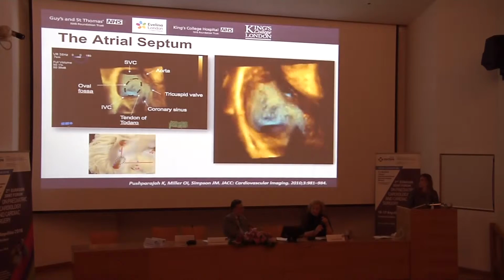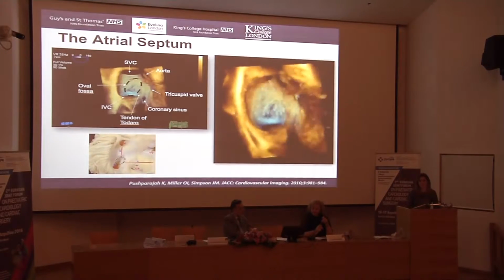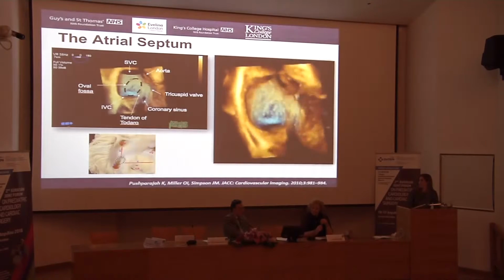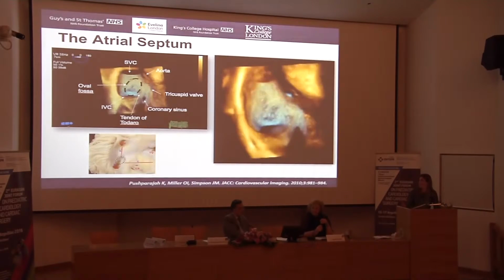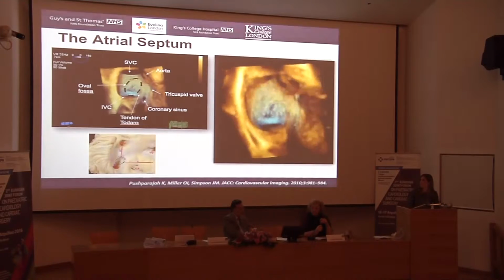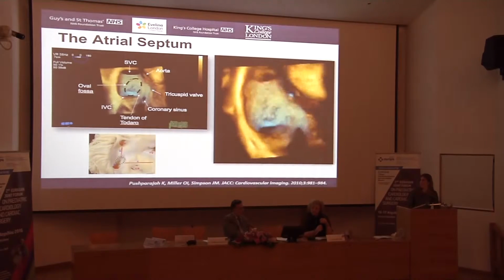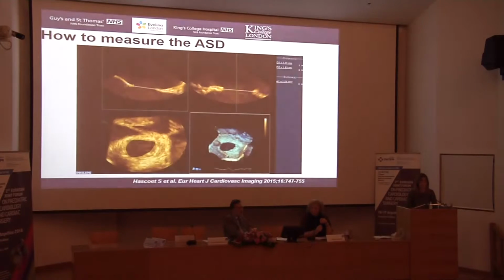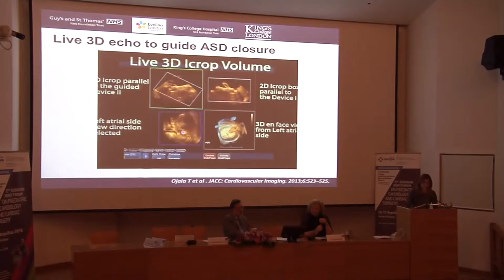This is a nice clip of a full picture of the atrial septum, as it is visualized from the right atrial aspect. We can understand the surrounding structures, the mouths of the SVC and IVC. We can see the oval fossa and the defect in the middle. But apart from the anatomy, we can do accurate measurements. Using zoom 3D and MPR format, we can measure the minimum and maximum dimensions of the ASD.